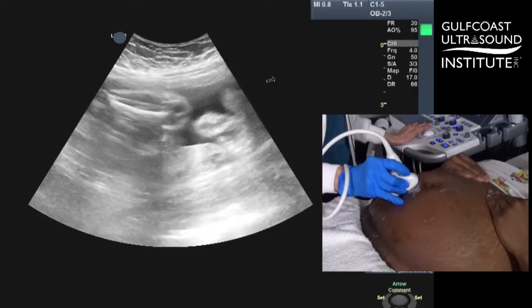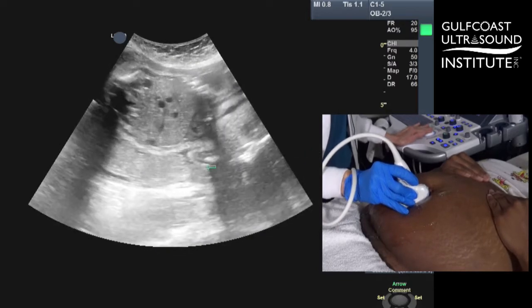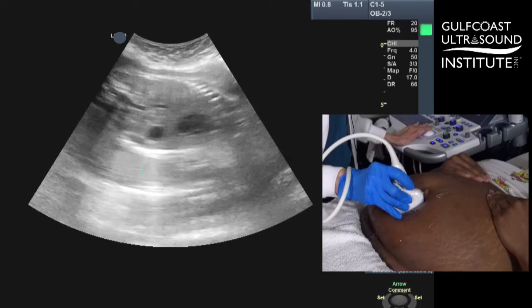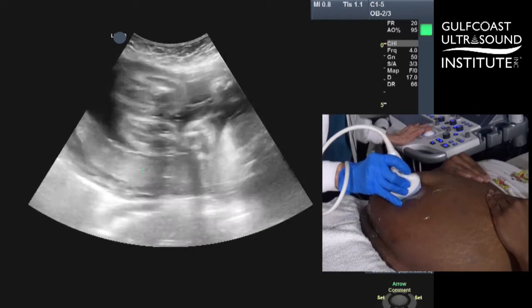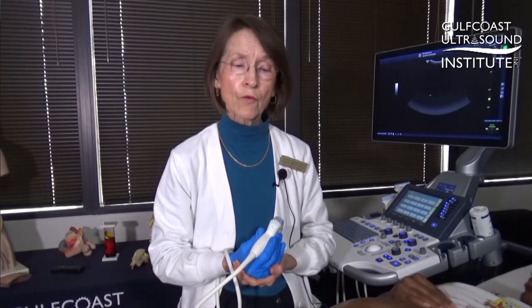Again you see the lie of the placenta along the back of the uterus, fetal heart, over towards her left one last time, over towards her right with fetal extremities lying on her right. What that does for us is it gives us a lot of information before we start doing any measurements or getting information about the fetus itself.